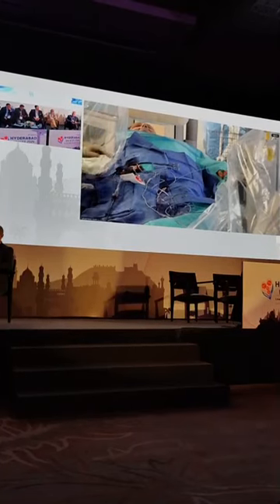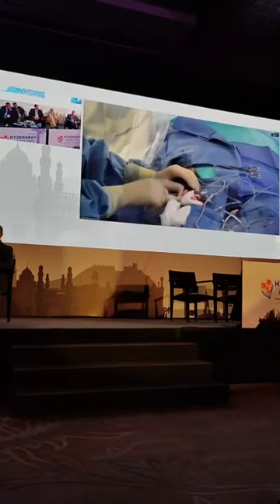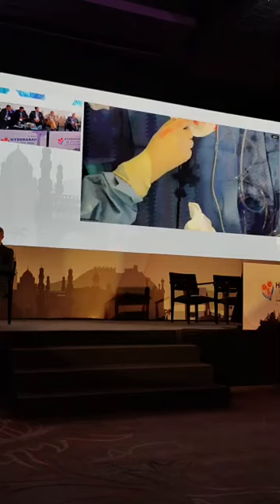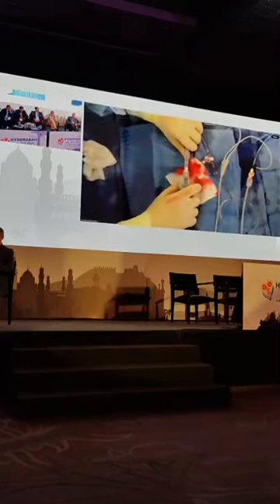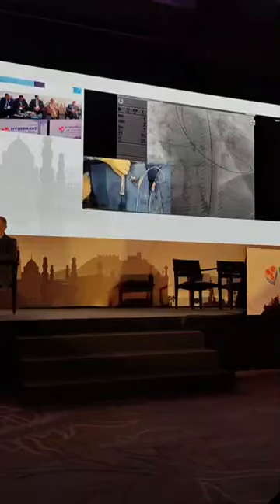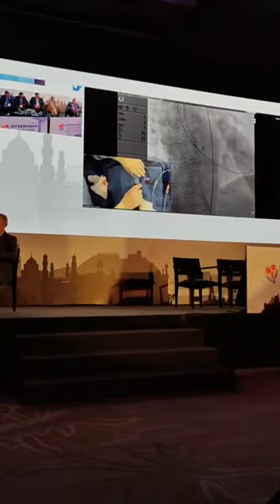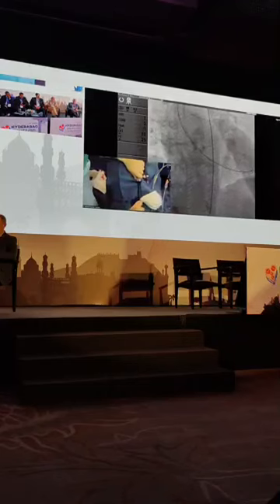So we are introducing. Alors, on peut voir les mains. Now we are at the entrance of the 14th French introducer, and I will advance the catheter with the loader. And each time also we have to pay attention to the guide wire in the LV. Si on peut avoir l'enjeu en même temps, les deux. Okay, because we don't want to be ejected from the left ventricle. So I am holding with my left hand the introducer and advancing the delivery catheter, which advances very easily.